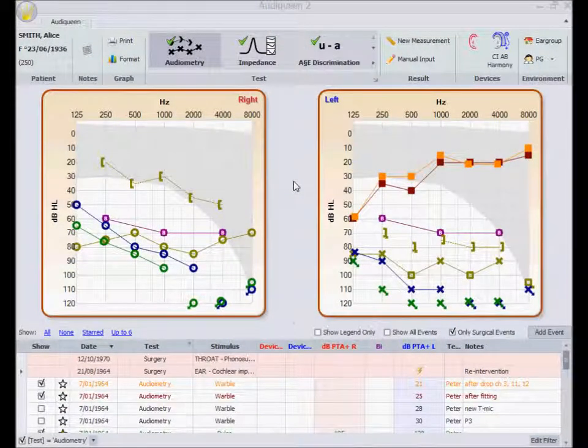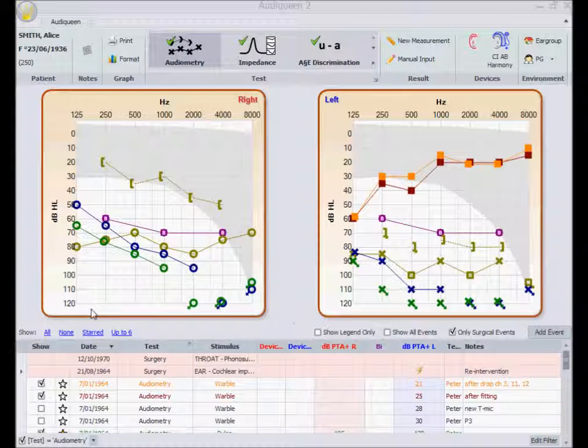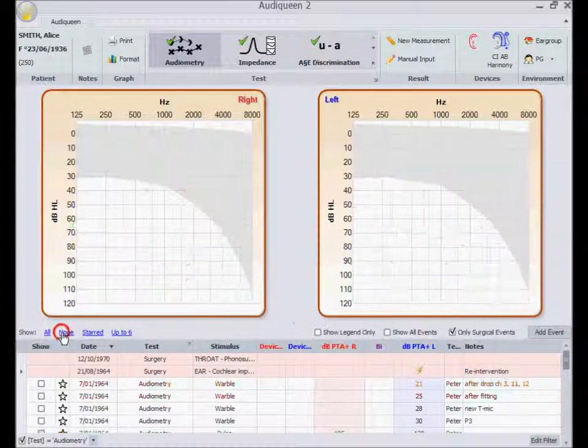This demonstration patient underwent many different tests. This graph shows a number of the audiometric results. You can select which results to display.